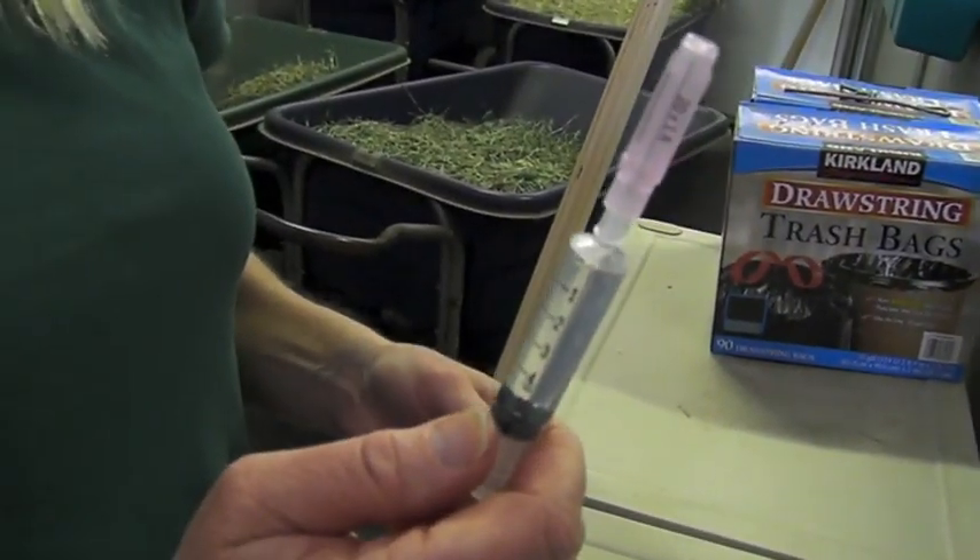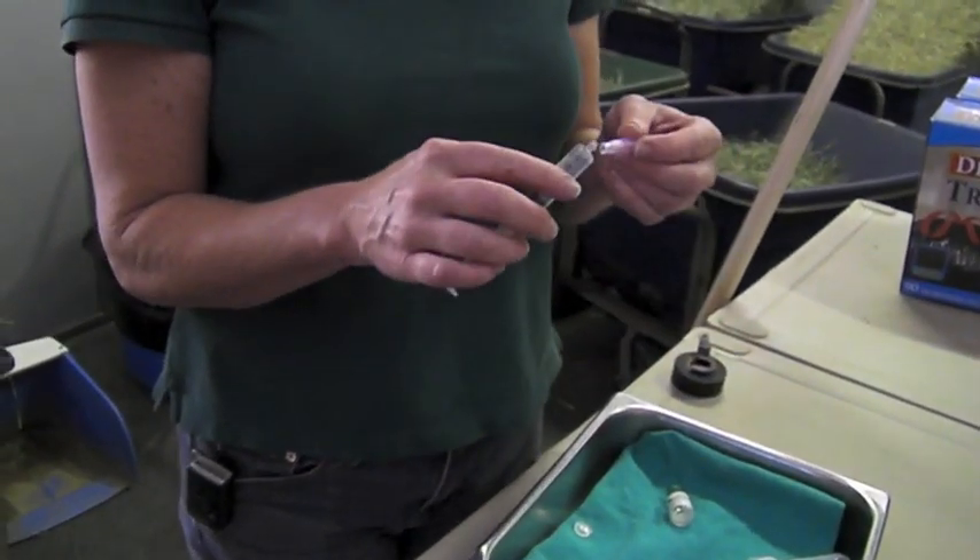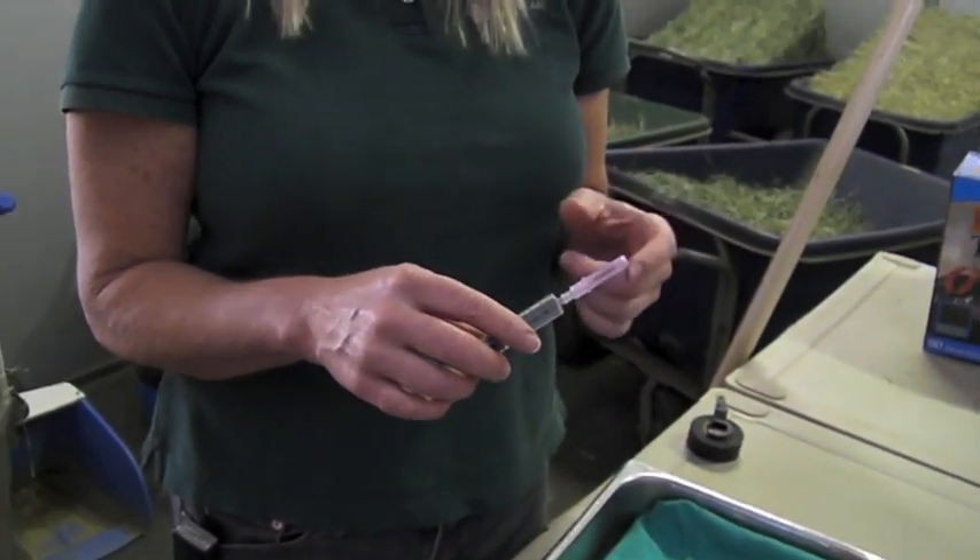One tip I like to give people, especially for horses that don't like shots: after drawing up the medication, go ahead and get a fresh needle. What happens is there's a coating on the needle, and once you put it through the rubber stopper it takes the coating off. Now we're going to go to the horse.